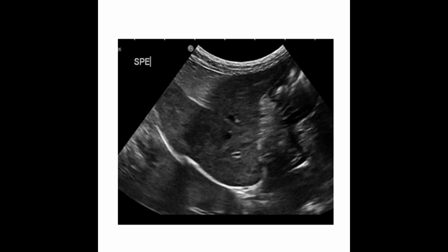So here's an example of the diaphragm. Again, this is another really common place that we see it, and that's because the liver has a little bit faster propagation speed than soft tissue. So here we have the diaphragm, and it looks almost broken in this area. And it's not really broken. What occurred is that this spot here most likely was traveling a little bit faster than 1540 meters per second, so the strong reflectors of the diaphragm were placed a little higher or a little more shallow.